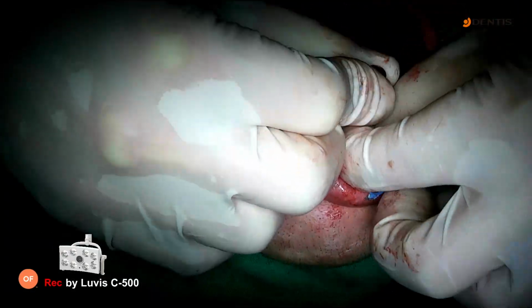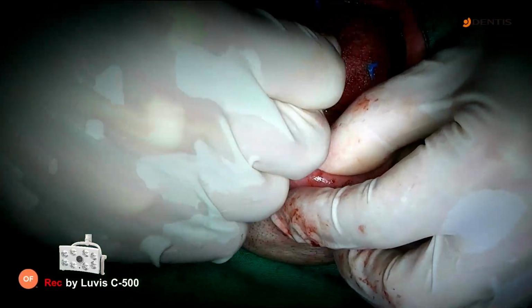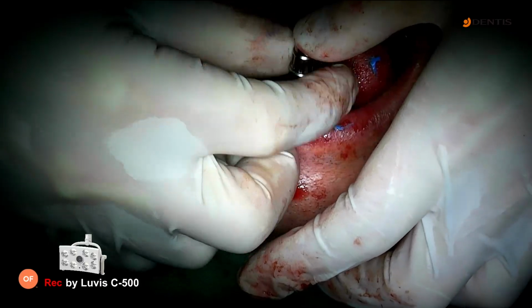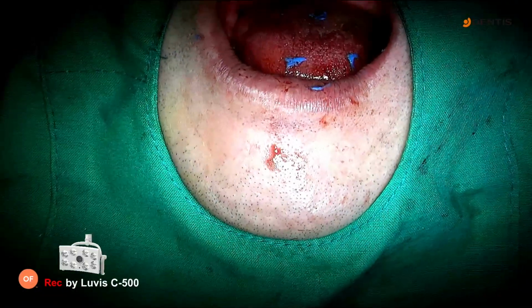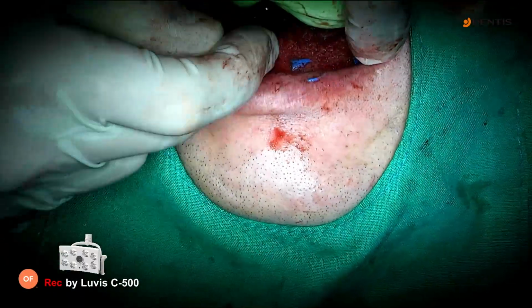Some of the impression copings interfere with some of the bone. So at the time of impression coping insertion, please feel for free insertion, without interfering with the adjacent marginal bone area. Okay, number 4. Okay, and then this is the putty index from before tooth extraction. So I already made this one.